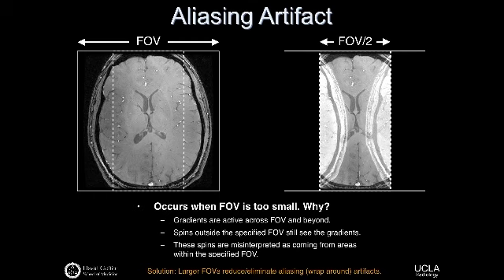This is the phase encode direction. That's the direction in which this thing is folding over and aliasing. And if you look carefully in the AP direction, there's image information or object. There should be object up here, right? There should be some subcutaneous fat, maybe a little bit more parenchyma, whatever. And in principle, you might expect that to be aliasing across the bottom here, but it turns out aliasing doesn't occur in the frequency encode direction. It's because of how we sample the data, we can avoid that artifact in the frequency encode direction.